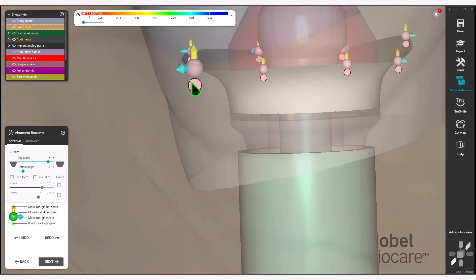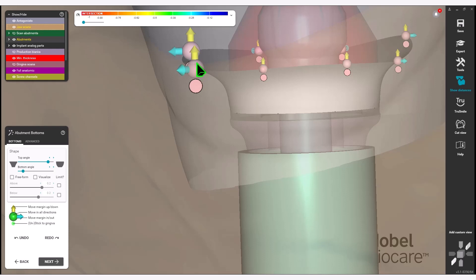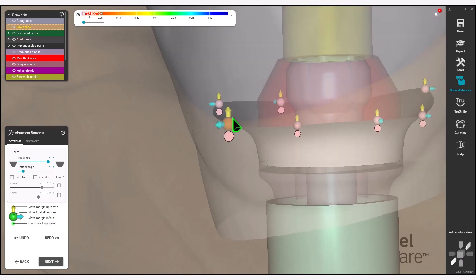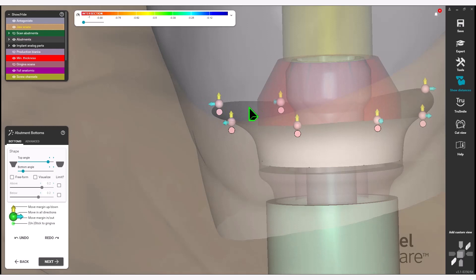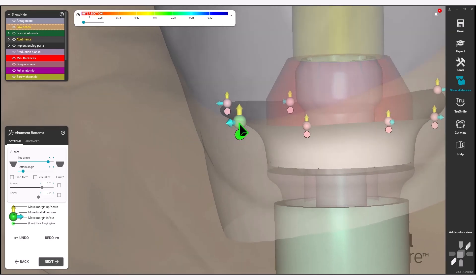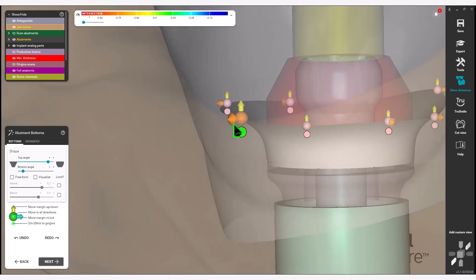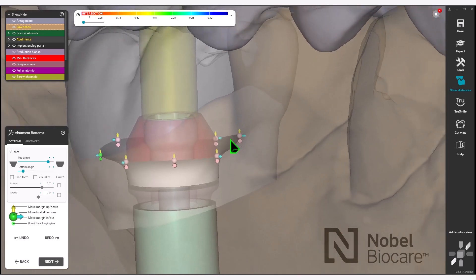You will also notice there is a pink sphere, which will enable you to magnetize to the soft tissue. If you select the sphere to move it, it will align and magnetize to the soft tissue profile. If you select the pink circle below, which turns it green, you can now move freely. Use the arrows to move in a specific direction to design your emergence profile.